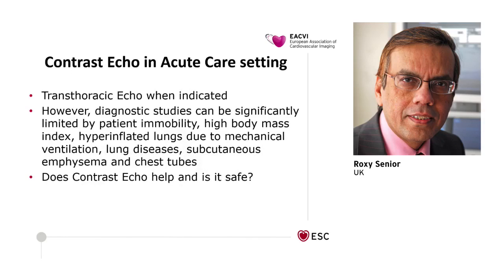So transthoracic echo, of course, should be performed when indicated. But we know that in the acute care setting, because of the unique situation, the image quality can be markedly compromised because of patient immobility, high body mass index, inflated lungs due to mechanical ventilation, etc. So the question is, does contrast echo actually help in the acute care setting, and is it safe? So I'll take you through some data regarding this first.